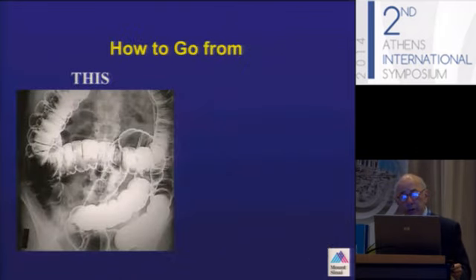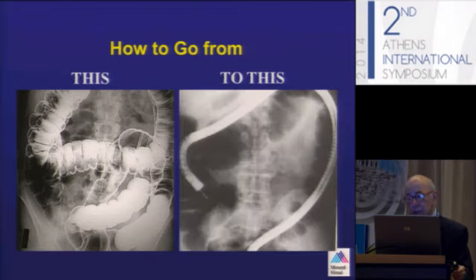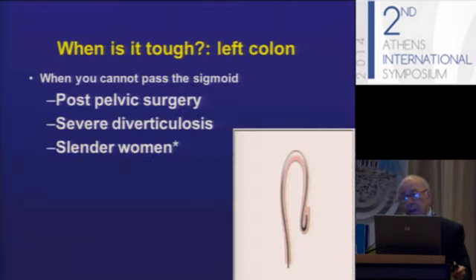So let's go on to the difficult colonoscopy. How do we do that? We want to go from a colon that looks like this to a colon that looks like that. And now, how do we do that? The way to do that is to observe the patient beforehand and decide what you have to do when you see the patient.